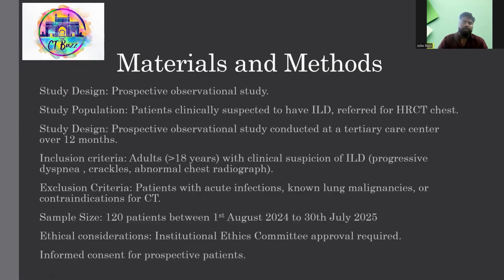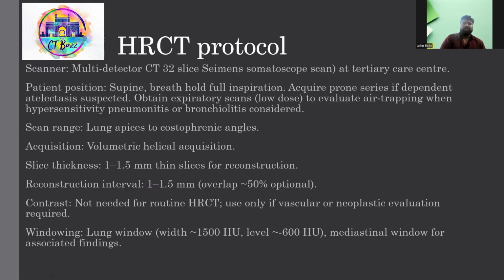Sample size was 120 patients over a period of one year, that is 1st August 2024 to 30th July 2025. Ethical considerations: IEC approval was obtained, and informed consent from the participants was taken. HRCT protocol: the scanner was a multi-detector 32 slice Siemens Somatom scanner at our center. Patient position was supine, breath hold, full inspiration.